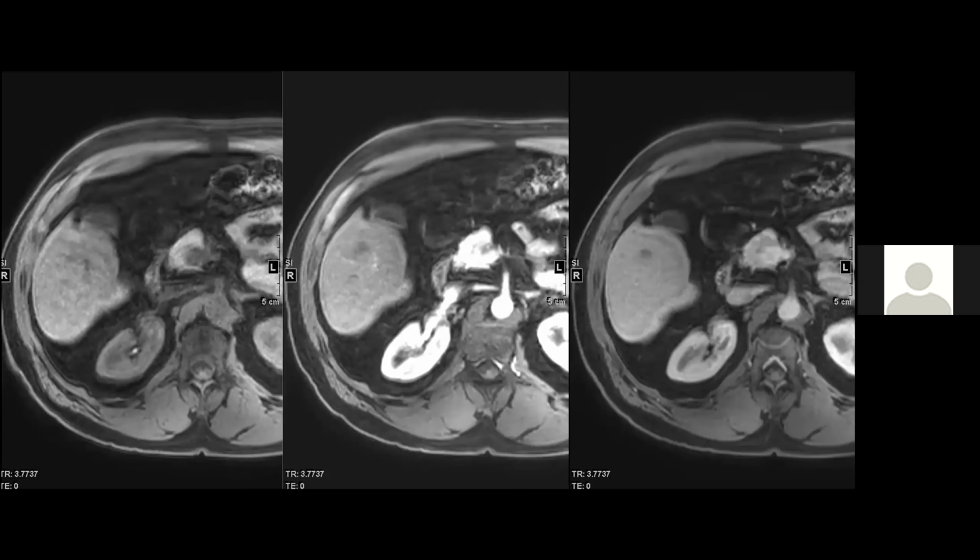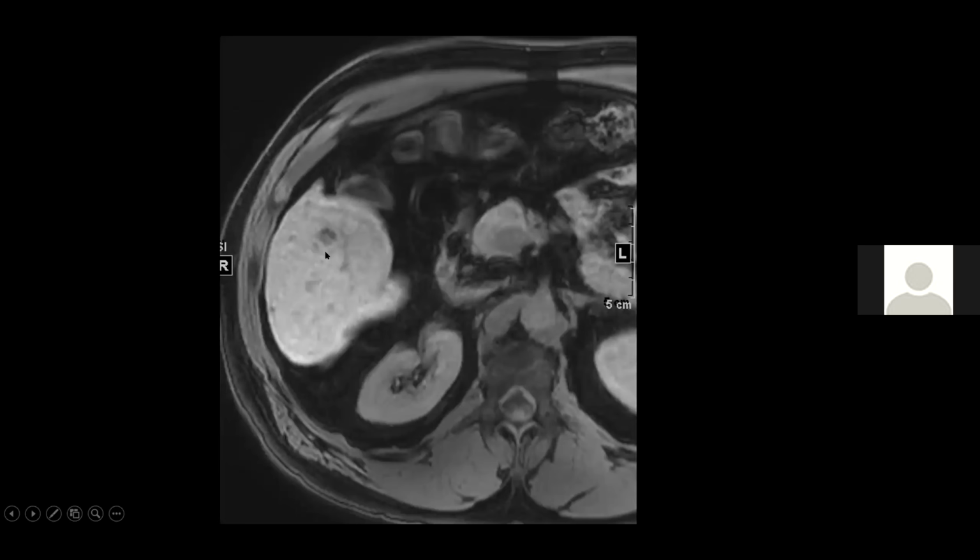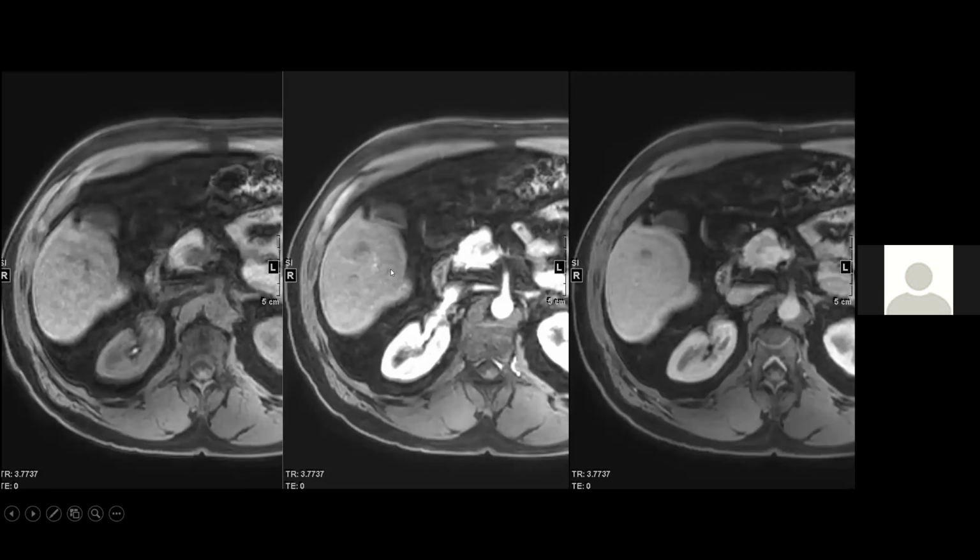Or should I just go through, Aarti? I don't have any thoughts on this. You can go. Apply LI-RADS. Right. So if I just gave you this and you would apply LI-RADS, it would be LI-RADS 3 or 4, right? Because you have no arterial phase hyperenhancement, but you do have what looks like washout appearance. So that would give you 3, and you can kick it up to 4 here. Right. So let's continue through the case.